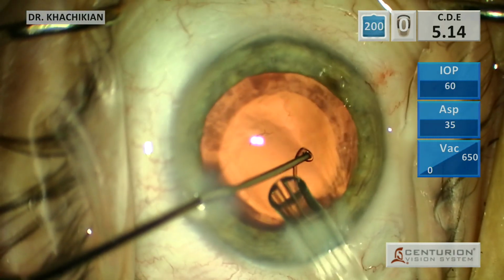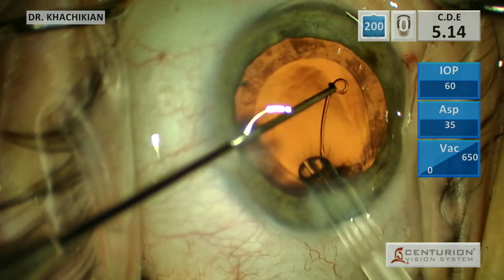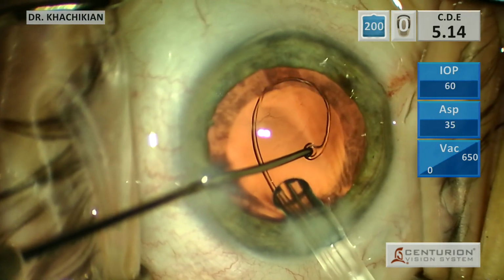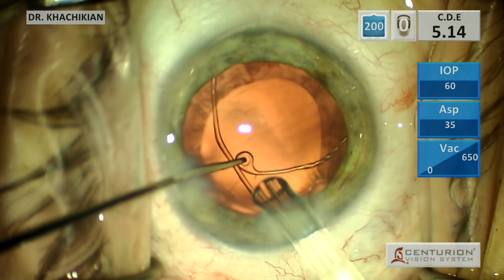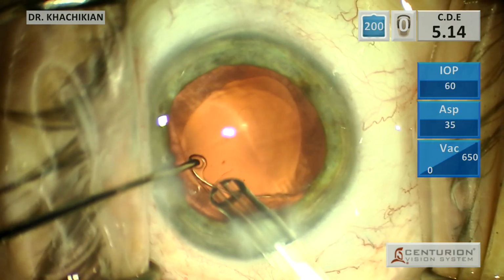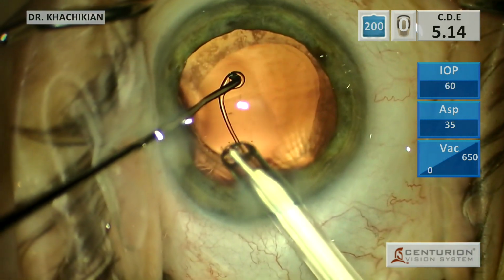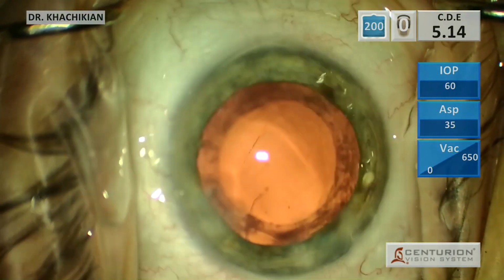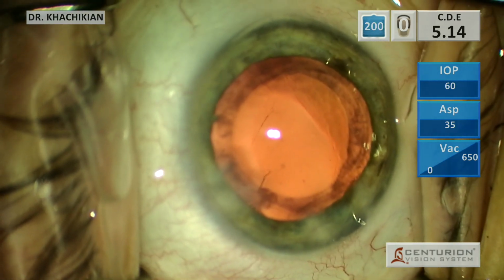We're going to put it in that leading eyelet. As we inject, we're going to let the large, blunt portion of the capsular tension ring push into the bag. I don't like having that leading eyelet push around and maybe catch on some weak bag and tear it. You just have to make sure you move that eyelet and let it rotate properly. Once that capsular tension ring is in, you can release both ends, and you can see that it goes in without too much distortion.